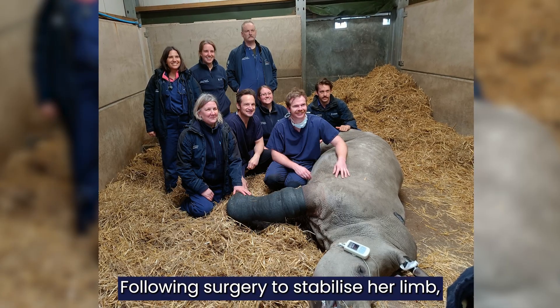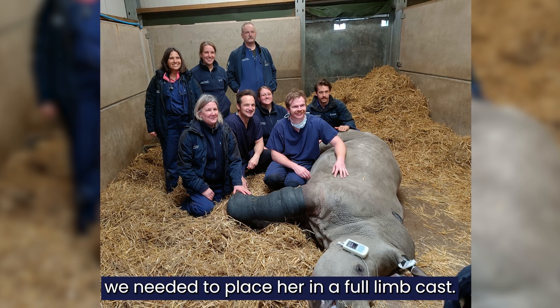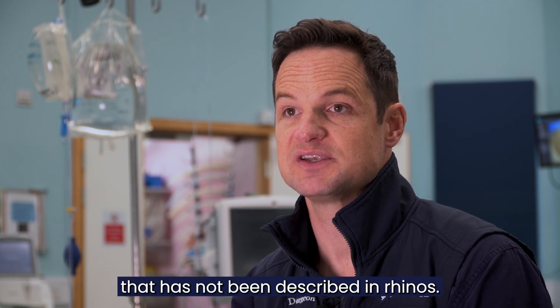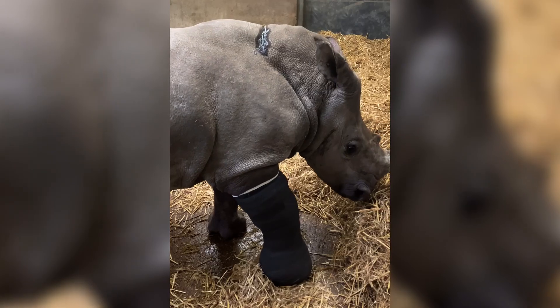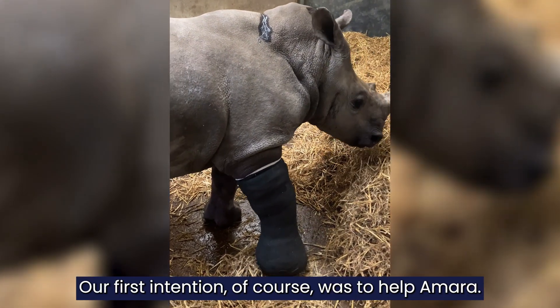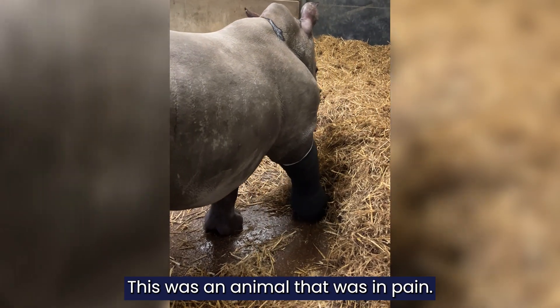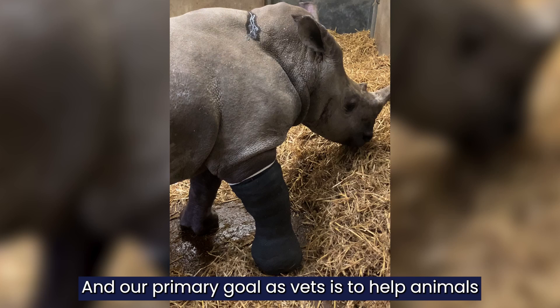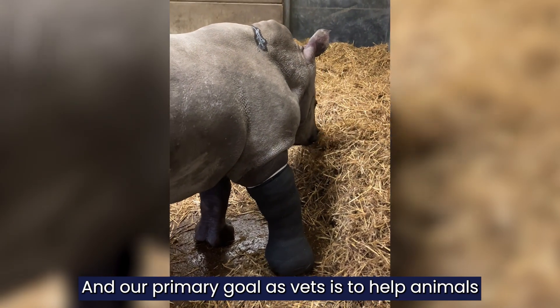Following surgery, to stabilize her limb we needed to place her in a full limb cast. What's novel about the surgery is that we were dealing with a fracture that has not been described in rhinos. Our first intention of course was to help Amara — this was an animal that was in pain, she had a broken leg, and our primary goal as vets is to help animals who are in pain.